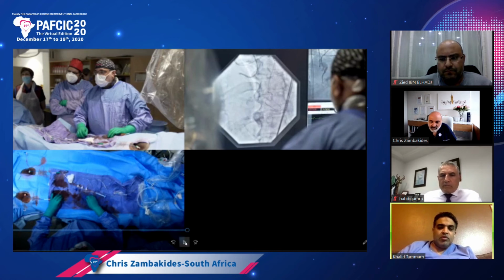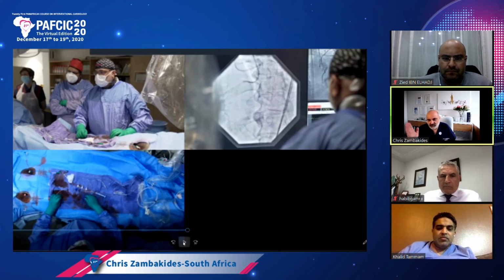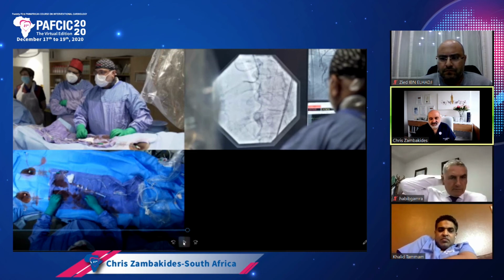Well, normally for the catheter that I'm going to go retrograde with, I'll always choose a catheter that gives me enough backup. So in this case, it's an EBU, an extra backup guide catheter. Most of the time I'll go with 7 French, which gives me extra backup. And yes, if I'm struggling, I could always put in a Guideliner.